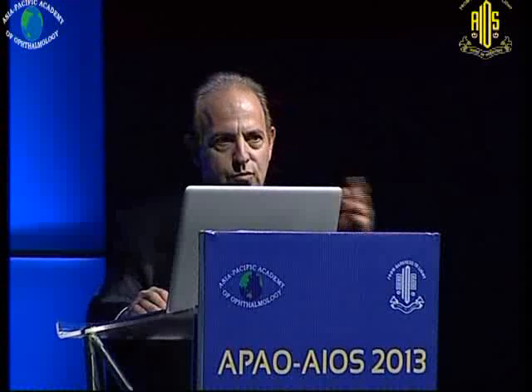Here's a patient complaining of decrease of vision in the left eye. We can see changes in the vitreous. On the fluorescein we see leakage from the retina on the area where there is vitreous traction, and of course on the OCT we see the hyaloid, the vitreous traction, we see what's going on, we see the splitting in the retina. I think that OCT is complementary to fluorescein. I tend to use them both simultaneously, and I think the fluorescein does have a major role to play.